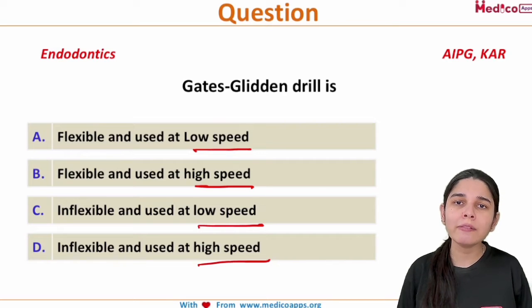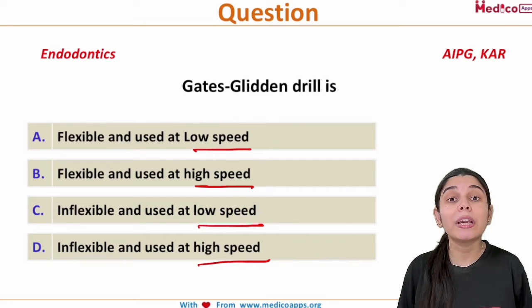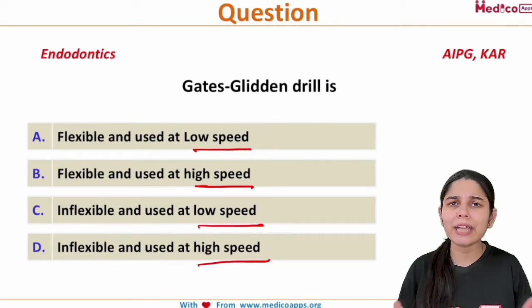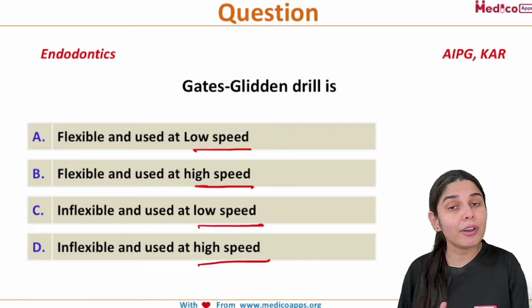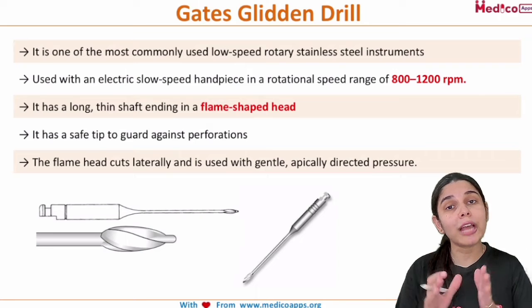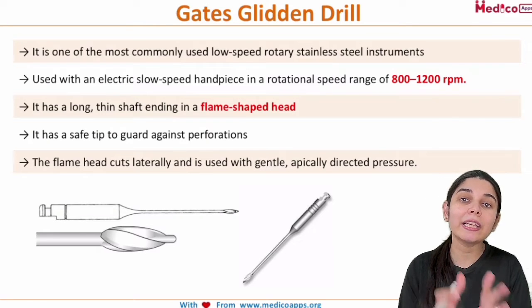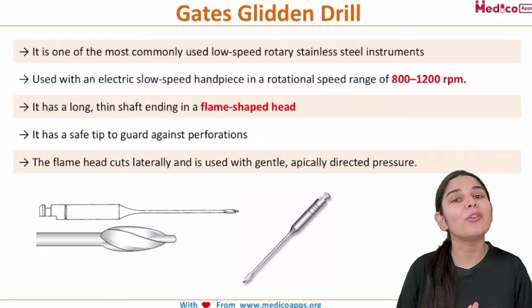So to resolve this MCQ, we need to first understand and learn about Gates Glidden drill. What exactly is this Gates Glidden drill? Let's start by understanding this concept so that you will be able to resolve this MCQ by eliminating the other options and getting the right answer.